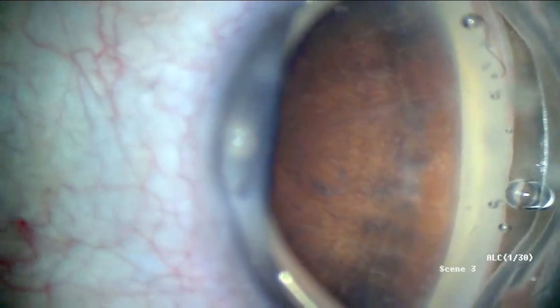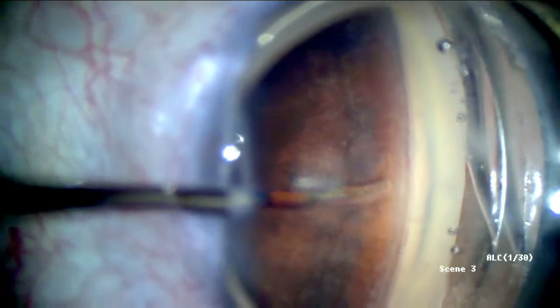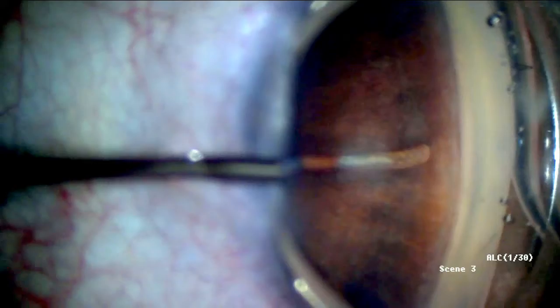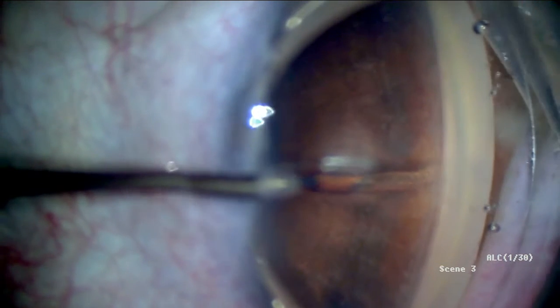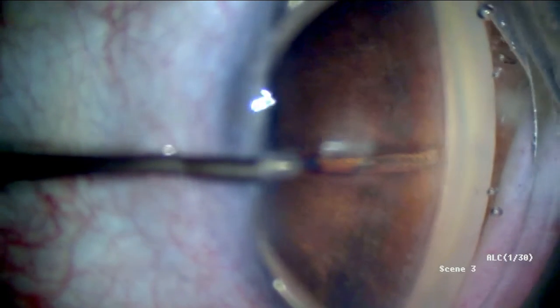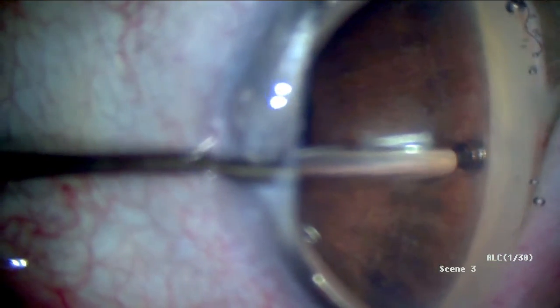The anatomy is very visible now. The guide wire enters the eye through the primary incision and is advanced so that the tip is placed against the hard stop of the nasal scleral spur. You can see me feeling for it, pushing right on the scleral spur — a hard stop. The device is then inserted by advancing forward and down, sliding off the scleral spur, and following the curve of the sclera.